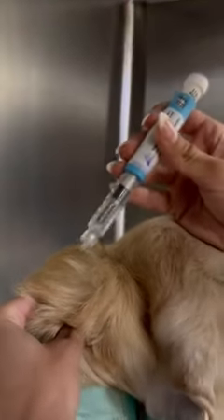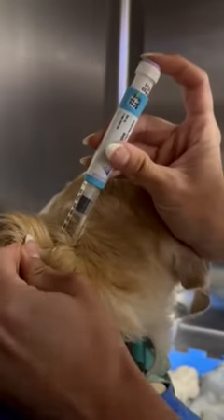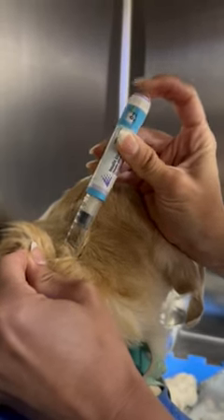I'm going to separate his hair so I can see where his skin is, then go in and give that insulin, and hold for a second before coming out.